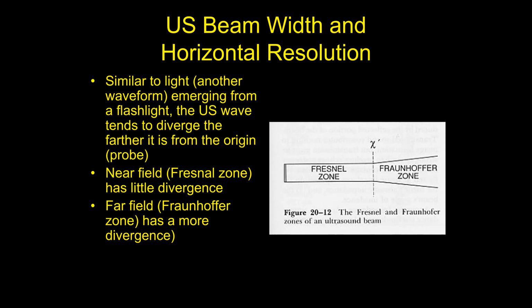But the deeper and deeper you get into the soft tissues that you're trying to image, so let's say now you're trying to image an adrenal gland that's 10 centimeters deep in the tissue. Okay, that sound that's coming out of the probe then does the same thing the flashlight does. The sound dissipates, it's not as powerful, so the image quality goes to hell.